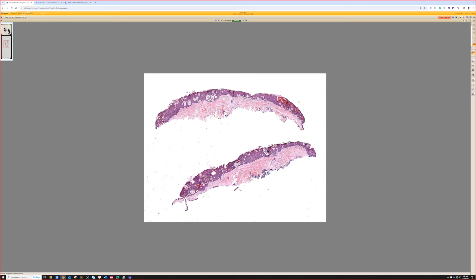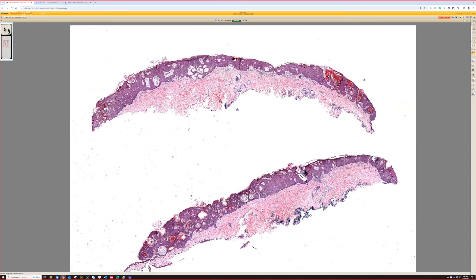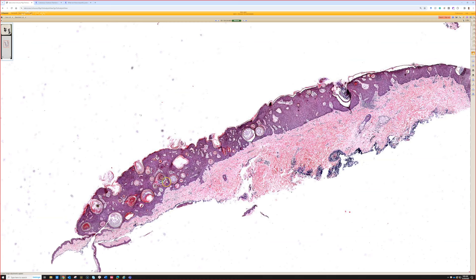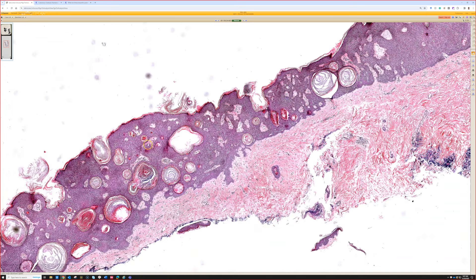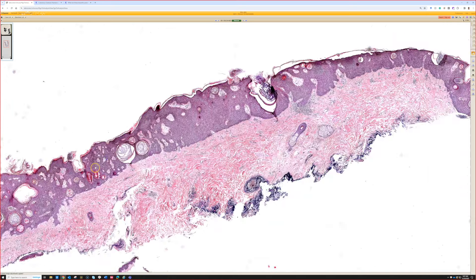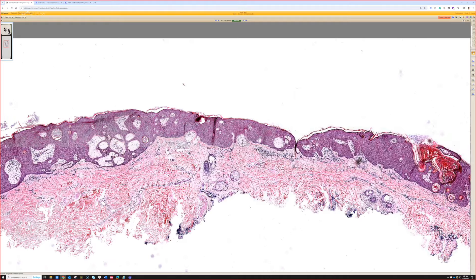This is case 22, a nice easy example of seborrheic keratosis: acanthotic bland keratinocytes, beautiful horn pseudocysts — some people call them pseudohorn cysts — with swirly loose keratin in them, a flat bottom or string sign under the base. You can see how it kind of overhangs the edge and is stuck onto the skin. All the classic seborrheic keratosis features are present.